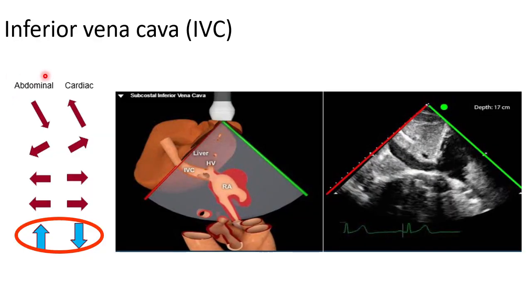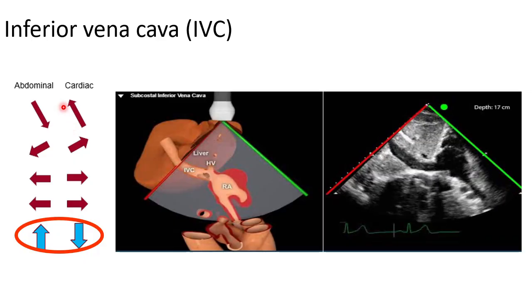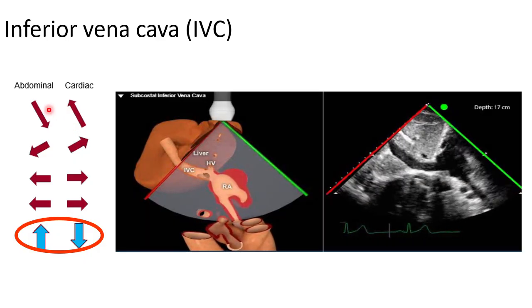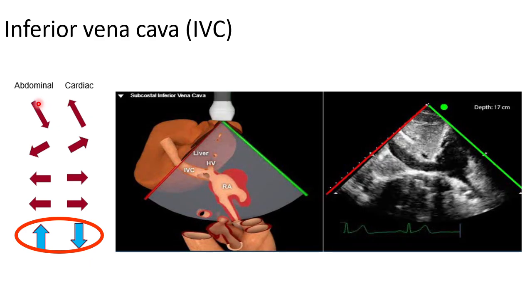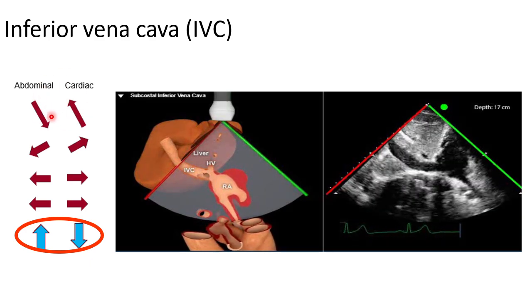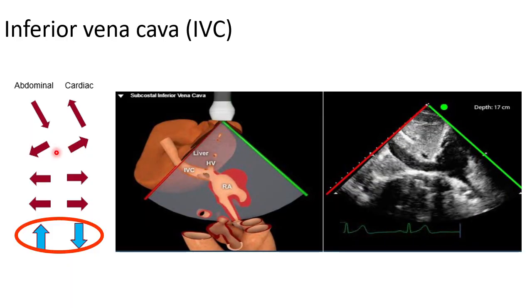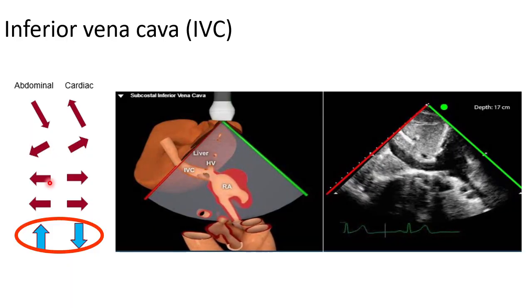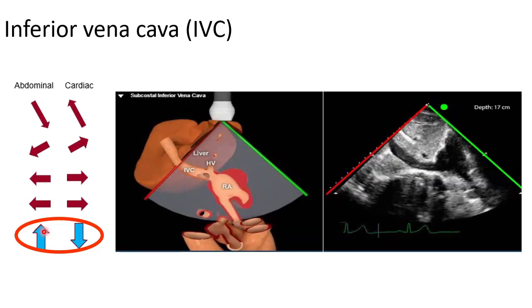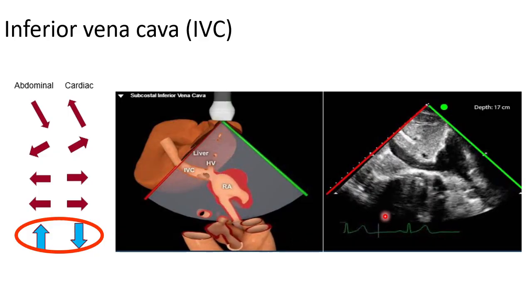So to review, you start with the parasternal long at first, apex will be at the left side of the screen. So you'll either be at the 5 or 11 o'clock position. Turn to the right, 90 degrees, get your parasternal short, come down and do the apical four chamber, the subxiphoid, and one more turn to look at the IVC, inferior vena cava assessment.